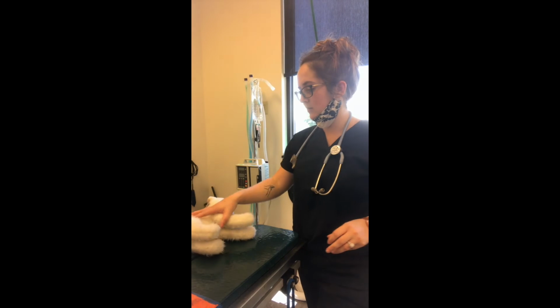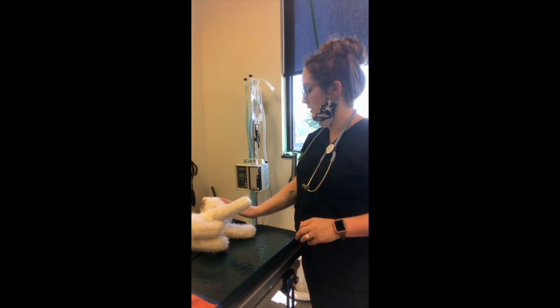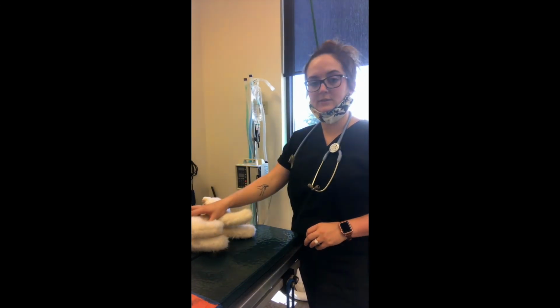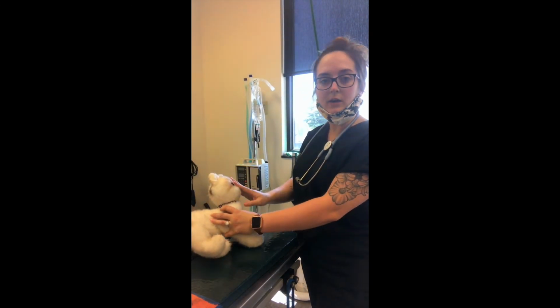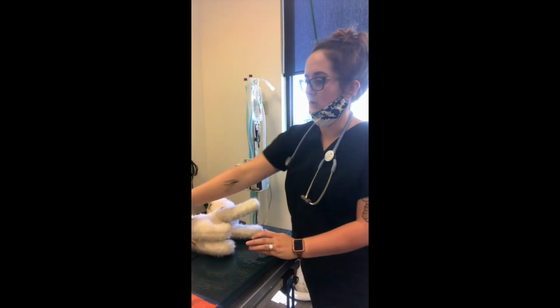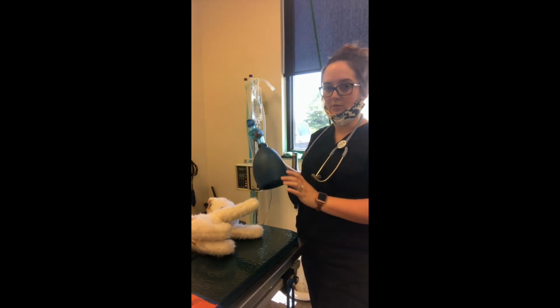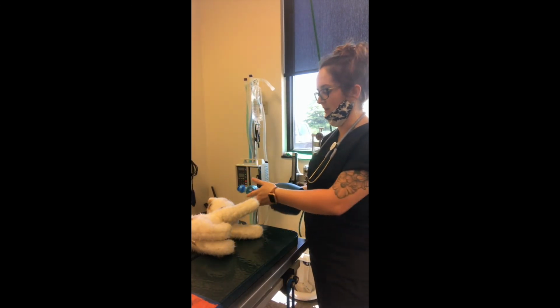If unfortunately your patient codes or goes into cardiac arrest under anesthesia, hopefully you would have an ET tube in place already. You could either use an ambu bag to manually give breaths after it's attached to the ET tube.